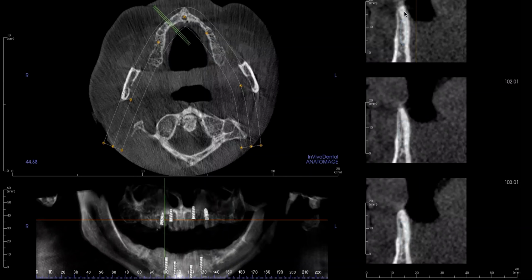Mini implants are non-osteo integrated implants. They have a low-grade titanium component to them. Therefore, they do not integrate into the bone, but they're not likely to break. Why do we have mini implants of that material? Well, the reason is conventional grade titanium is brittle at 3 millimeters or below. In other words, they're likely to break. The material has to change. It has to be more malleable and bendable and flexible. That's where they created the mini implant alloy.